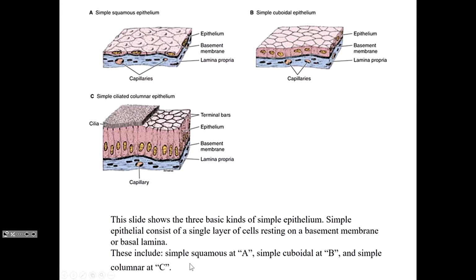So here we can see all of these. So the pink cells are the epithelial cells. And in all 3 cases, there's one layer of cells, which is then adjacent to a basement membrane, which is this kind of purpley structure here. So because there's one layer of cells, we say these tissues are simple. Okay, simple means one single layer.